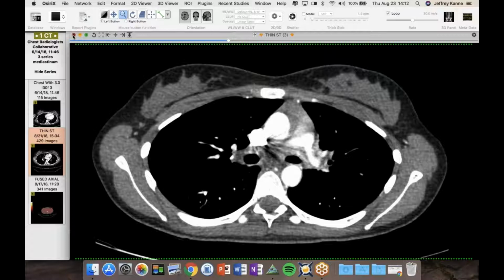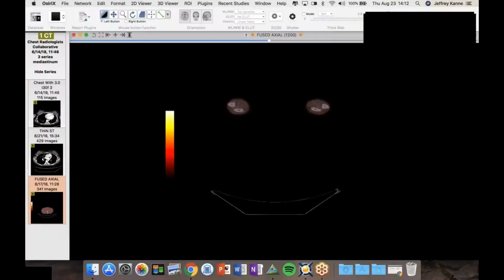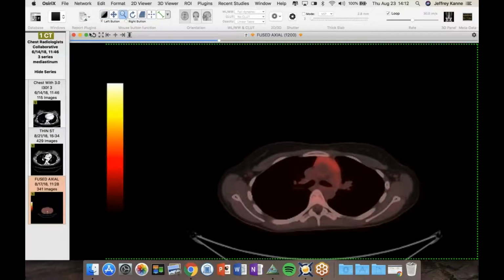This has been going on for three or so years, and it's just slowly progressing, which is typical of fibrosing mediastinitis. A malignancy would have declared itself. So Jeff, did you think that on the PET scan there was activity anteriorly, sort of in the thymic distribution? Was that anything abnormal, or is that normal? That's normal. Yeah. Thymic activity there. How old is she? You said 19. At 19. Okay, that's okay then. Thank you.